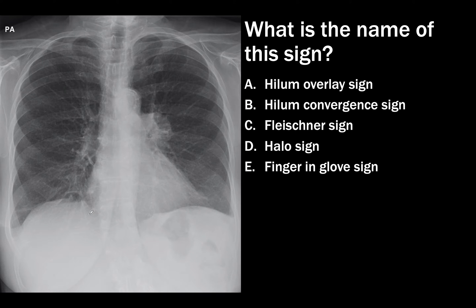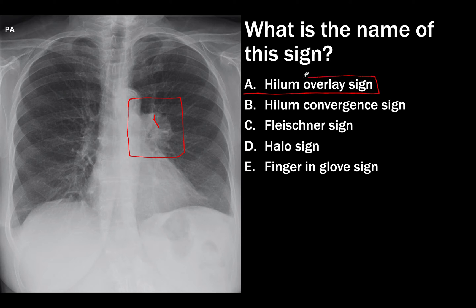Case 35. The question is: what is the name of this sign? The abnormality looks superimposed over the left hilum. The key question is whether this abnormality is in the hilum or somewhere else — anterior or posterior to it. We can see the hilar vessel here, very well defined, despite the abnormality being right on top of the hilum. Therefore, this is a positive hilum overlay sign, meaning the mass or consolidation is either anterior or posterior to the hilum. The hilum convergence sign attempts to identify whether a hilar lesion is due to vasculature or a hilar mass — so that's not correct.